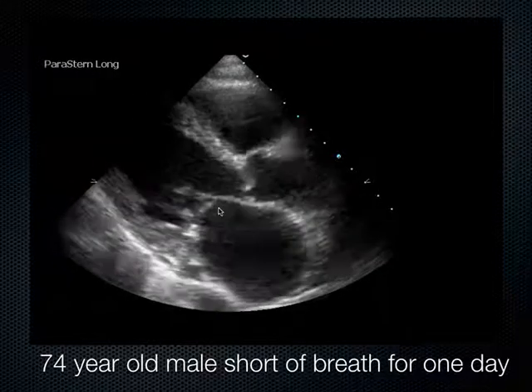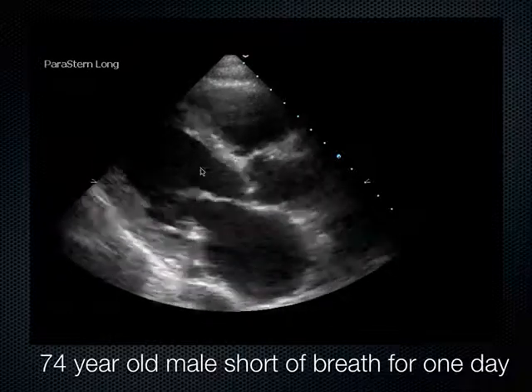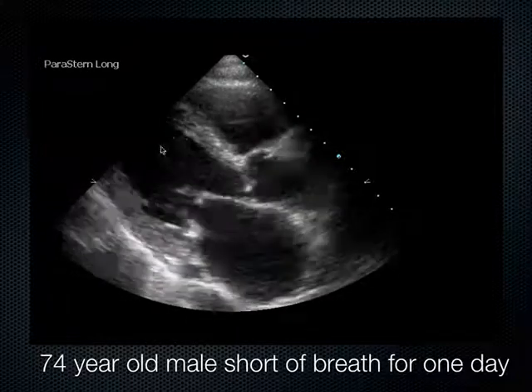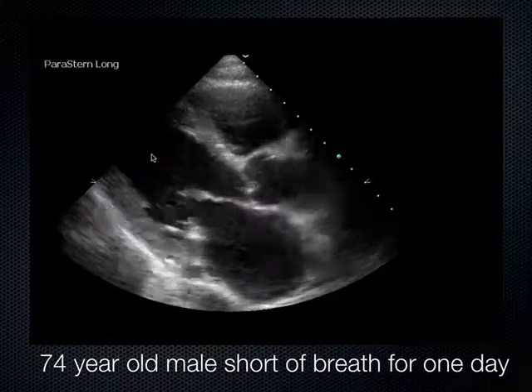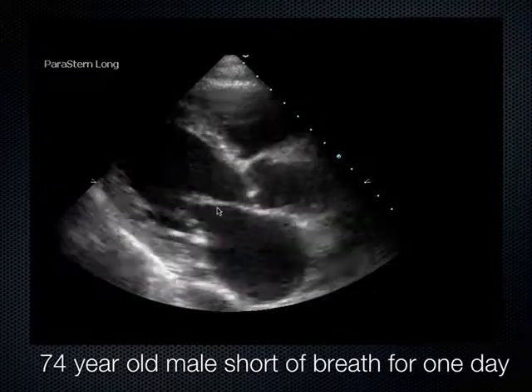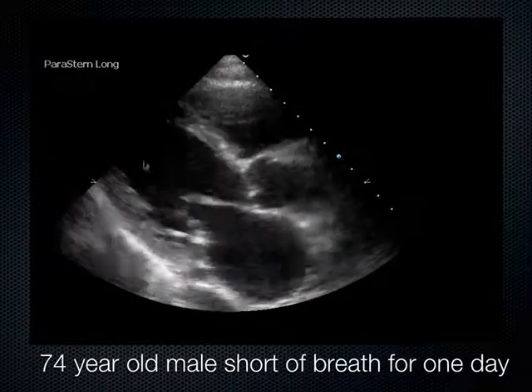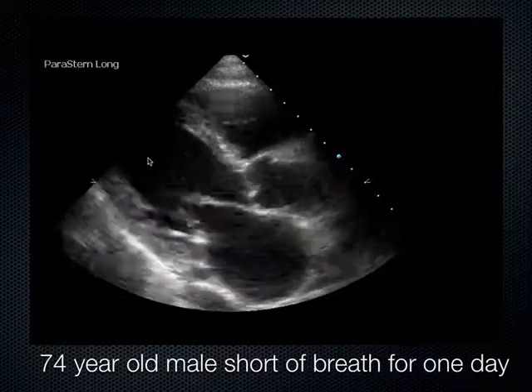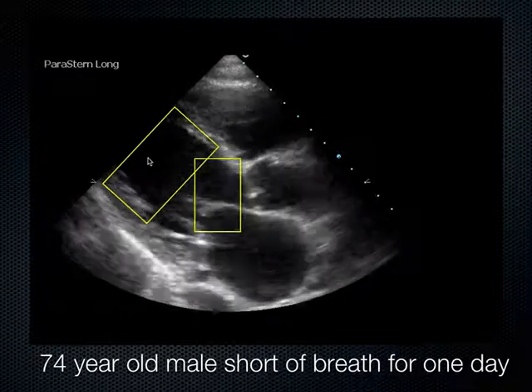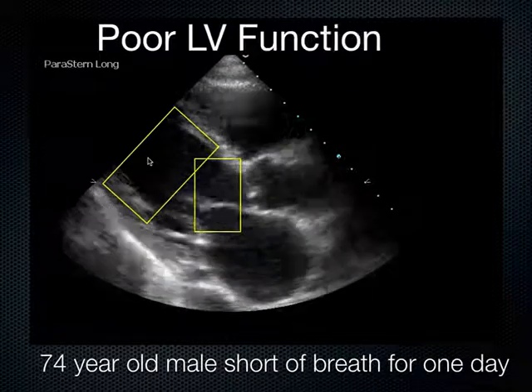And a couple things here. One is the mitral valve. I'm looking at the anterior leaflet of the mitral valve. It should come up and smack the septum. And I'm also looking at the posterior wall and the interventricular septum. They should squeeze together. And in this heart, neither one of those things are happening. Okay? So this mitral valve is not smacking the septum, and the septum and the posterior wall are not squeezing towards my arrow there.